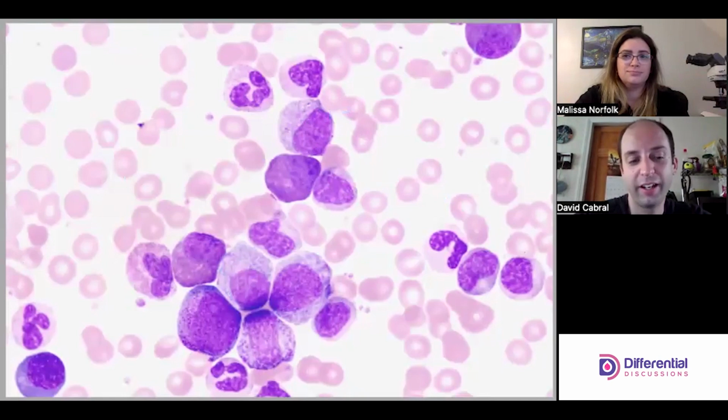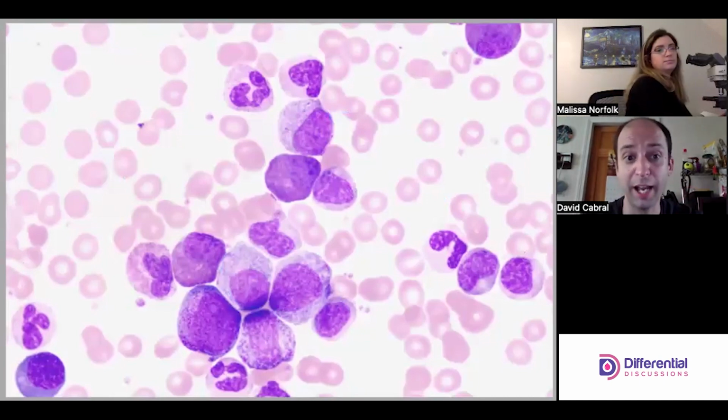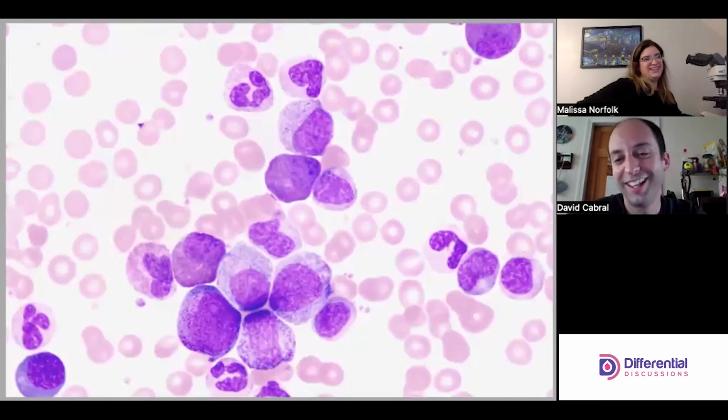I try to always stress that the context of the slide is really important. There'll be times in your career where you have to identify that one cell. I'm talking to you, Cap. Hopefully they give you a fair representation, but many times a lot of this is determined by the whole picture. And there's one thing I want to talk about. I don't want to start trouble.